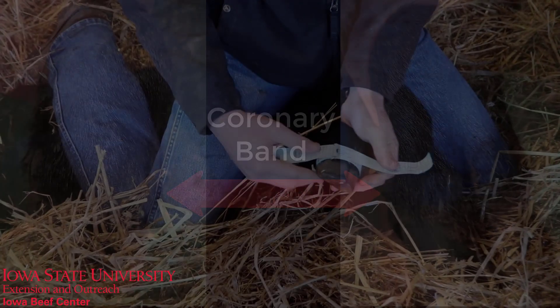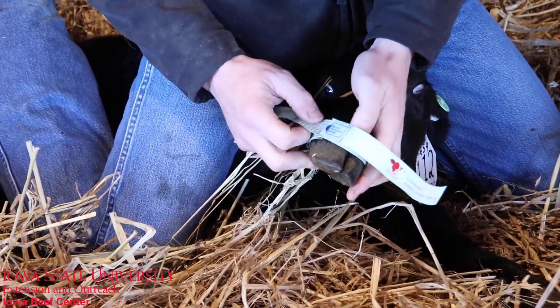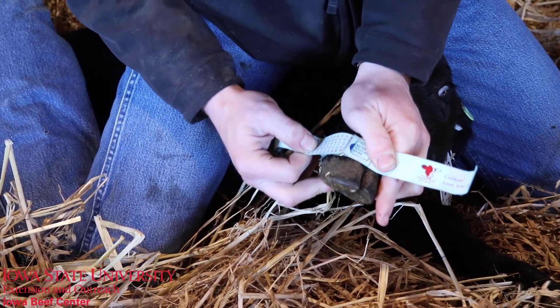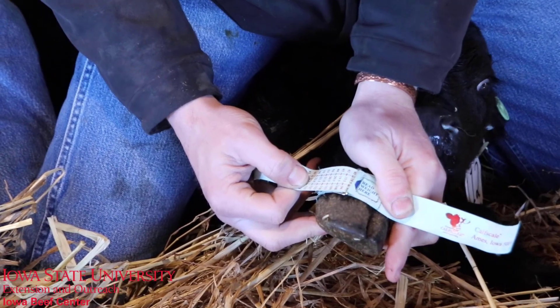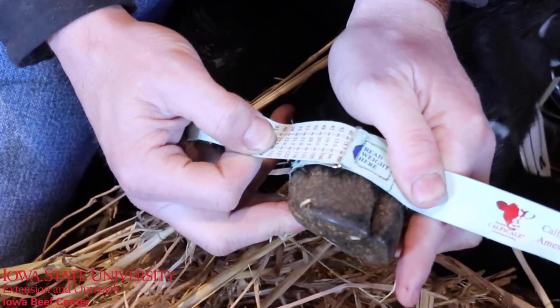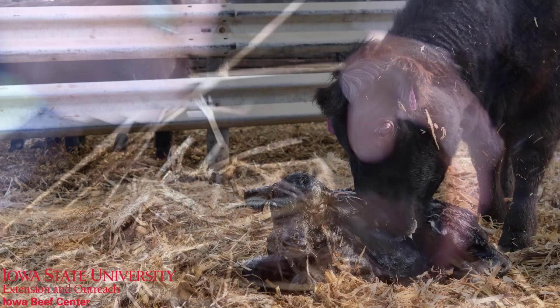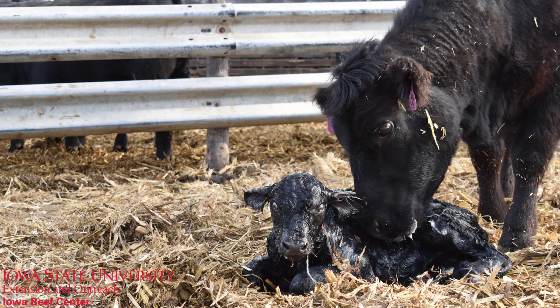When you're taking that weight, you don't need to pull the tape super tight. Just pull it taut and then you'll be able to read in centimeters and in pounds what your calf is. We've found over the years that our calf scale tape versus a spring scale weight within 24 hours will vary about 3 pounds.